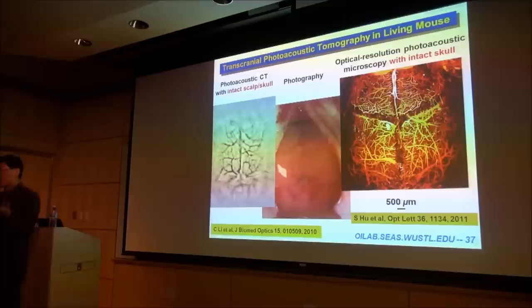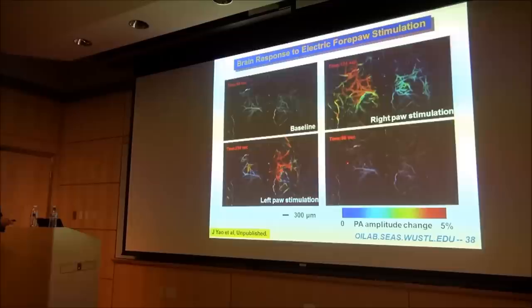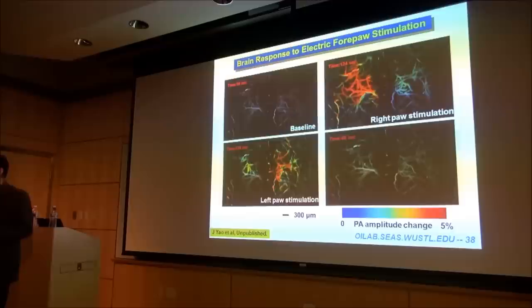Now this is a stimulation technique. You can see if you use forepaw or hind paw stimulation electrically, you'll see activation of blood vessels on a vessel-by-vessel level. Right, this can potentially be used to study both signal mechanisms, and Vivek and I were talking about this more.